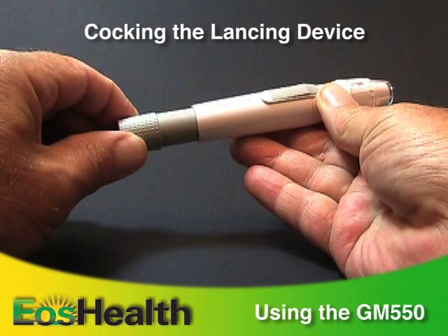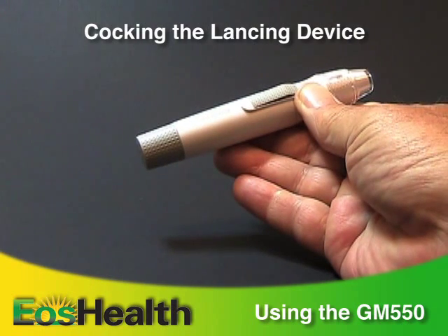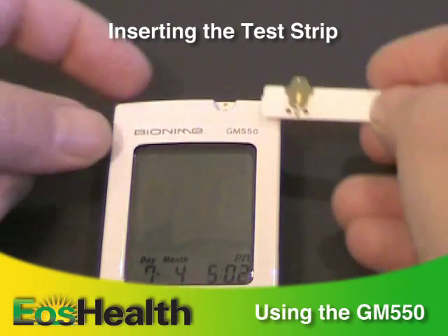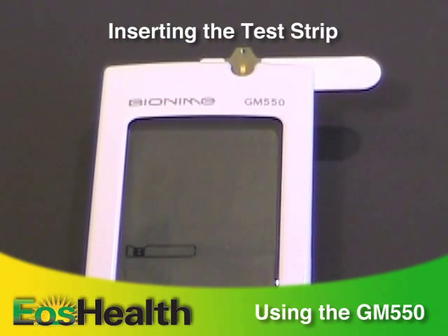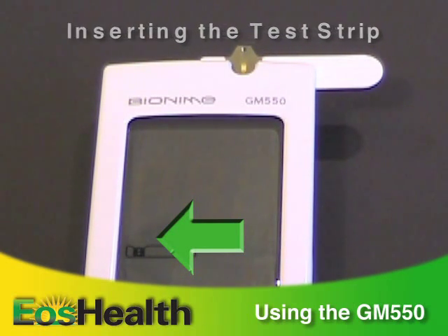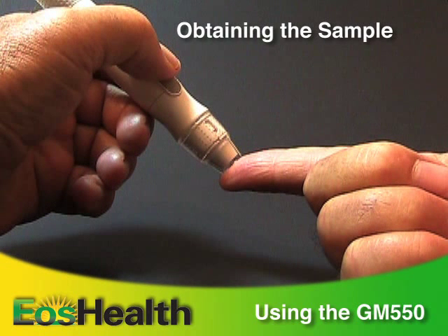Release the plunger and it will automatically move back to its original position. Be sure to wash your hands with warm soapy water before performing a test, and then insert a test strip into the meter with the indication symbol pointing up. The flashing blood drop symbol on the meter means you're ready to apply the blood sample. Place the lancing device against the pad of your fingertip and press the release button.